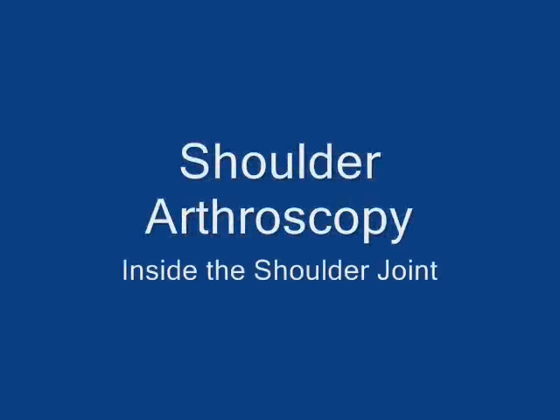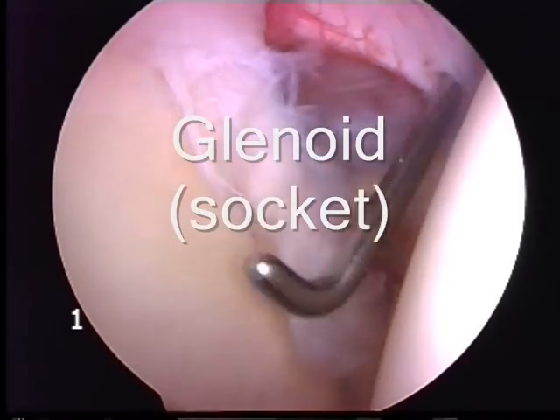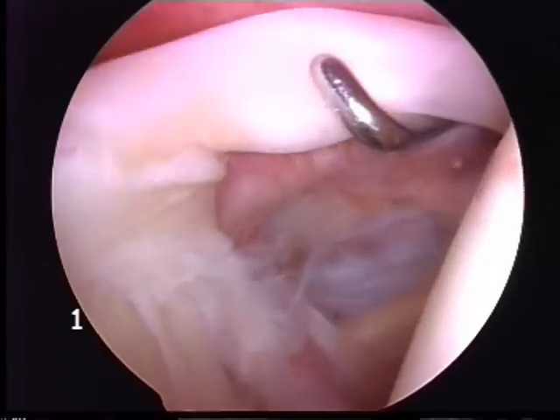This is a short video to demonstrate the anatomical structures within the shoulder. This round dish is called the glenoid, or the socket.